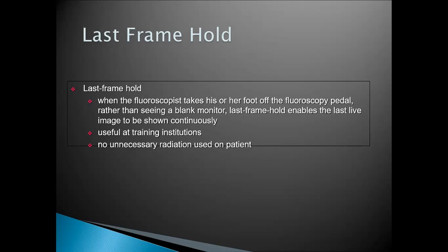In fluoroscopy, when the machine is working and maybe something goes wrong with it, instead of seeing a blank monitor, the last frame hold ensures that the last live image, the image that was captured last, will continuously be shown on the monitor. So it is very, very useful.